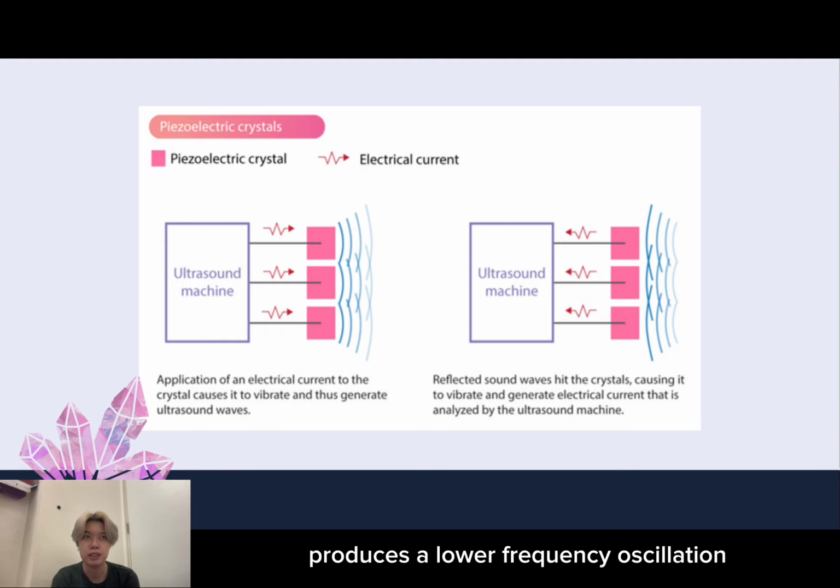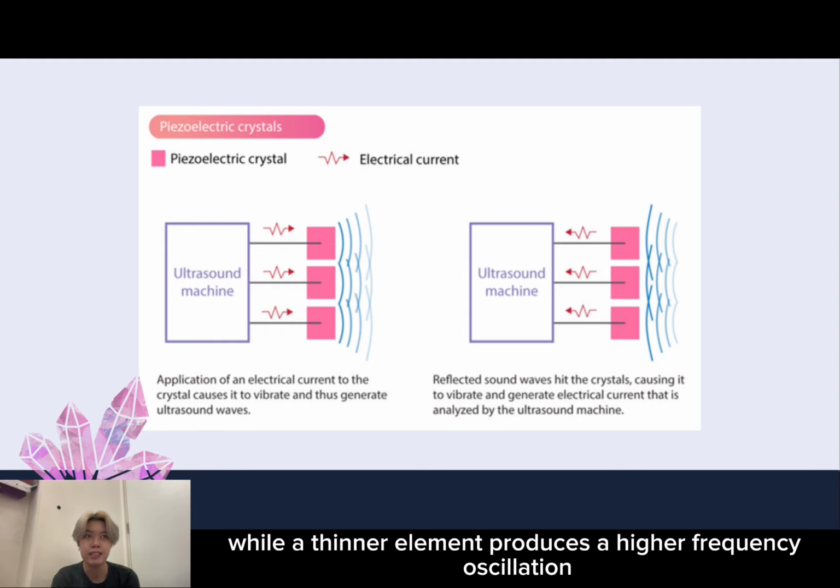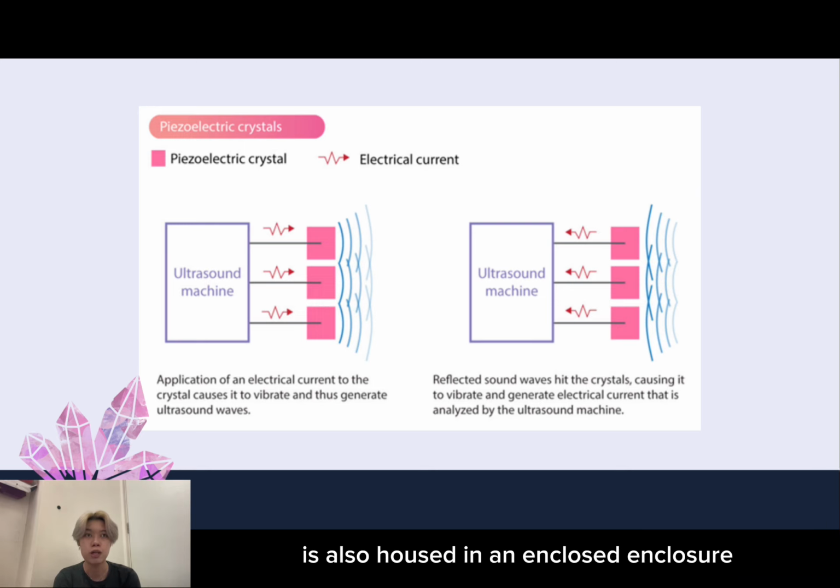The piezoelectric element's thickness is determined by what resonance frequency is needed. A thicker element produces a lower frequency oscillation, while a thinner element produces a higher frequency oscillation. The piezoelectric material is also housed in an enclosure which is acoustically treated.